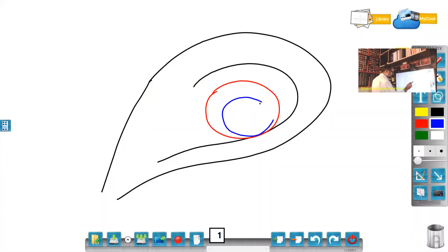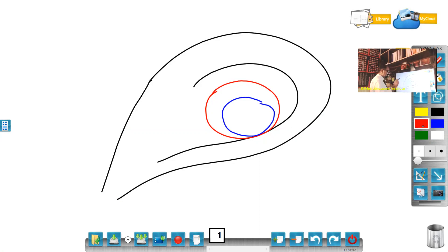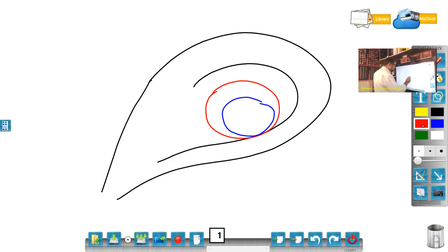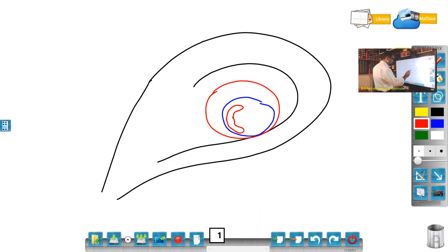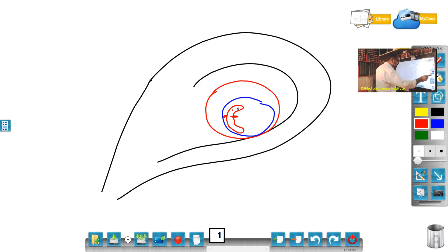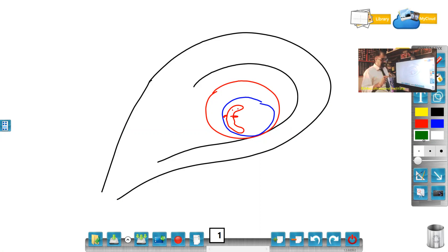This is the amniotic cavity. Where is the yolk sac? Before yolk sac, where is the fetal pole? The fetal pole is in the amniotic cavity over here. This is the fetal pole, this is the fetus. And this yolk sac is not in the amniotic cavity — make a note. This is outside, this is an extra-amniotic structure.